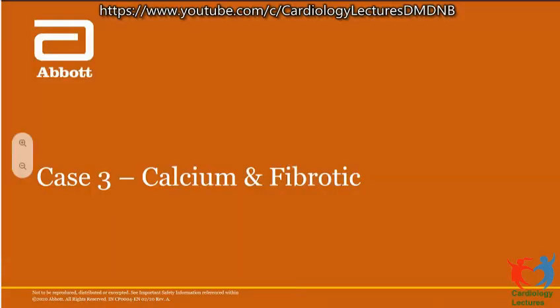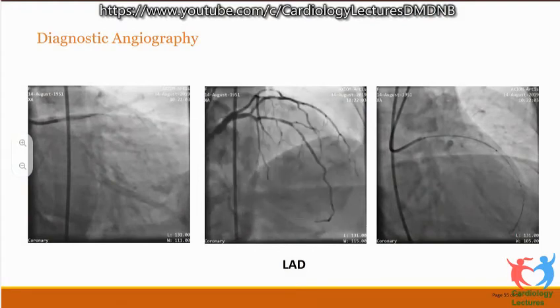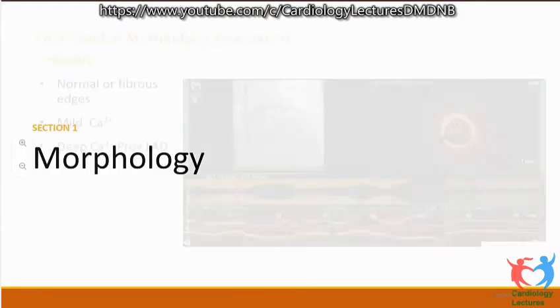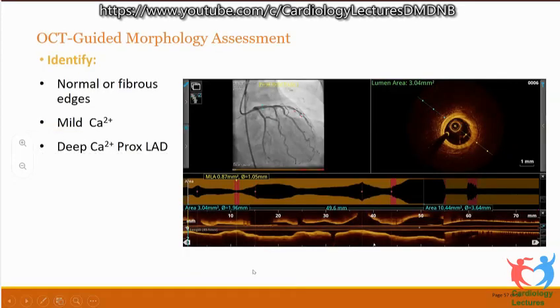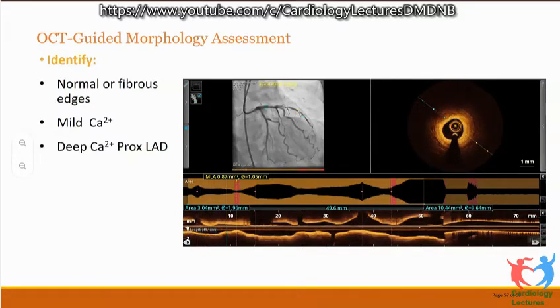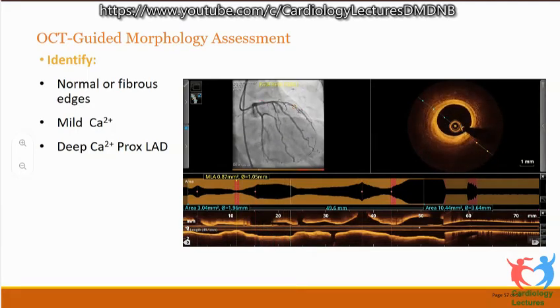Now to the third case, which had both calcium and fibrosis. This was again a young patient who had presented with chronic stable angina. We went ahead and did the OCT. Now this was the OCT run. It showed variable thickness of fibrosis and calcification. It's not one of those intensely calcified lesions, and was quite amenable to simple angioplasty tools.